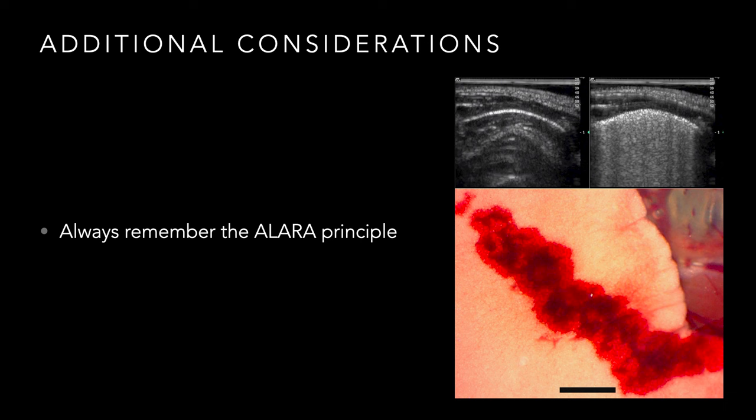Ultrasound is generally considered to be pretty safe. We scan eyeballs, we scan babies. It's not associated with the ionizing radiation of a CT scan or an X-ray. So it's pretty safe to do, but it is a form of energy. We are putting energy into the body, and whenever you put energy into the body, there are bioeffects that the energy can have.